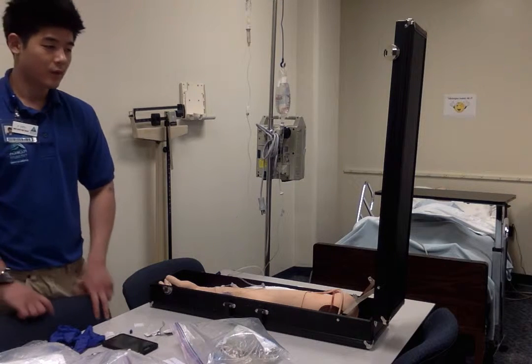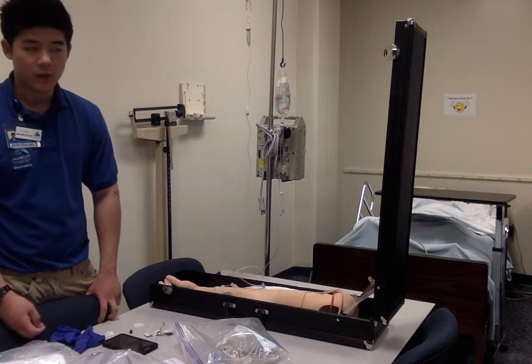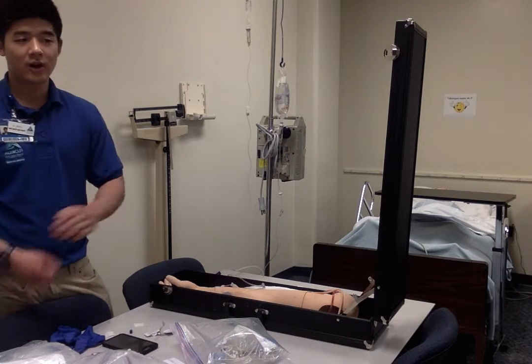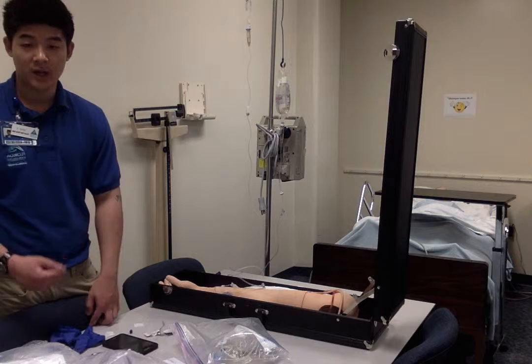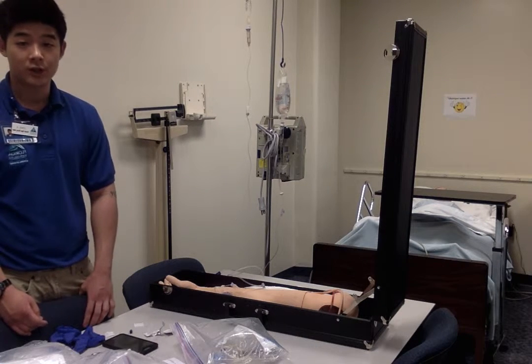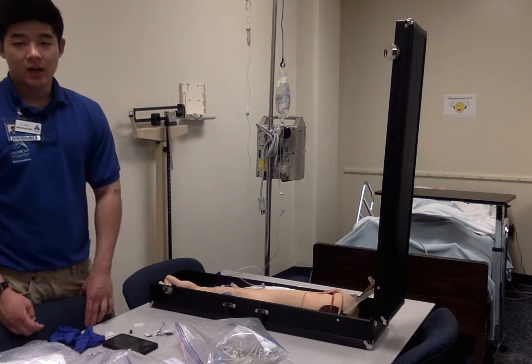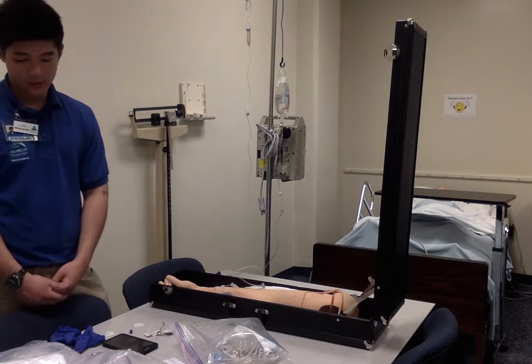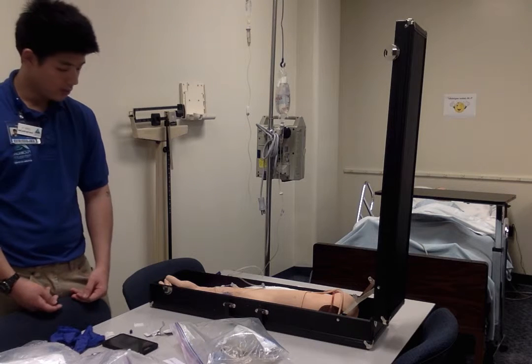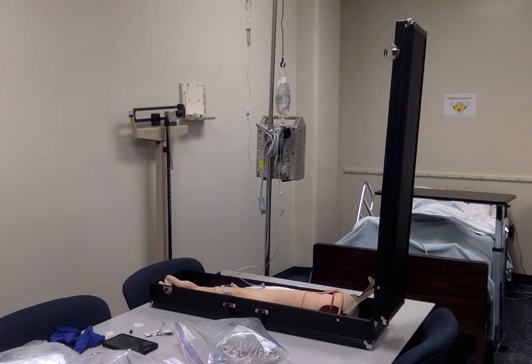administration record: the dosage, the route, how much, what was the medication, time, date, patient's initials, my initials, also how the patient handled the procedure, and intake and output for the patient for the procedure. And that'll be all.